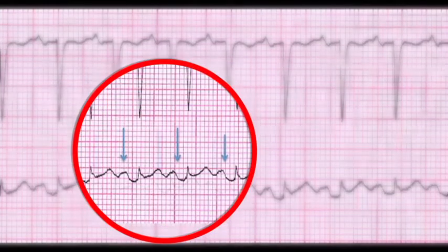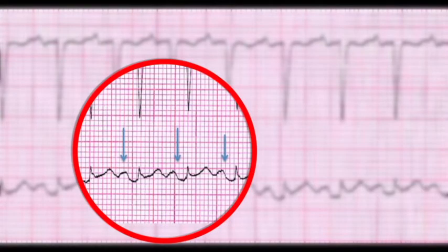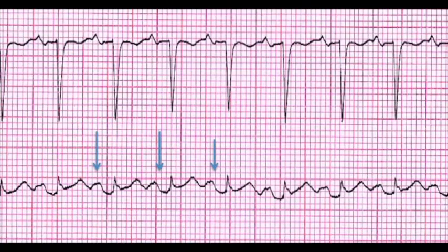Critical elements of the ECG that must be considered when interpreting the ECG of a narrow complex tachycardia are the presence of P waves, the characteristics of the P waves, including morphology, vector, and number of distinct P waves seen, the association of the P waves to the QRS complex, the ventricular rate, and importantly, the regularity of the rate.